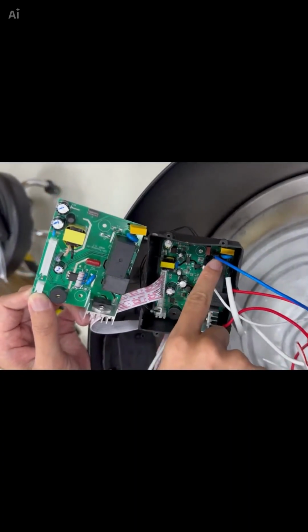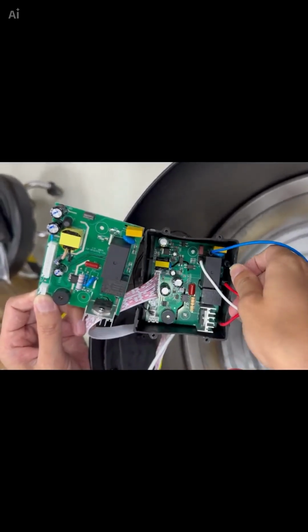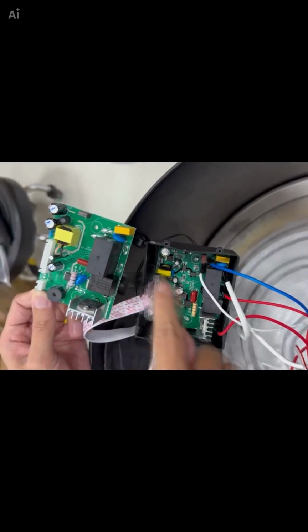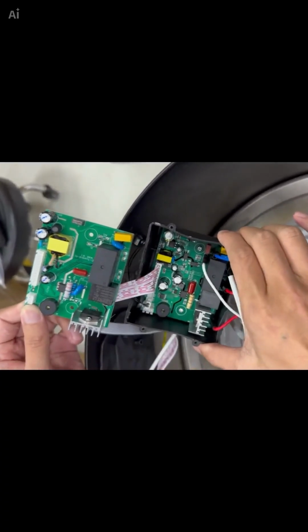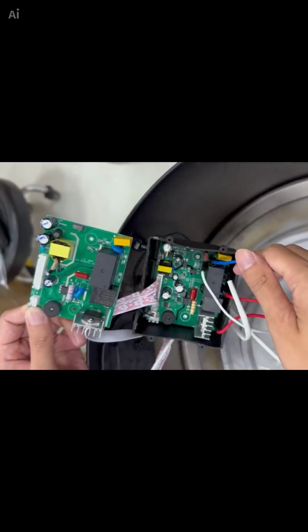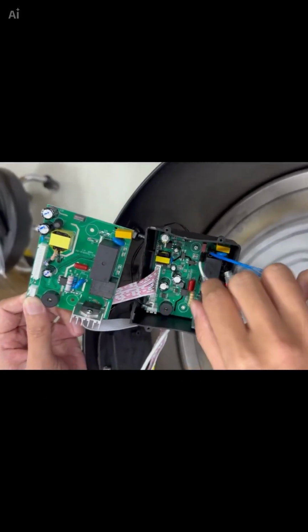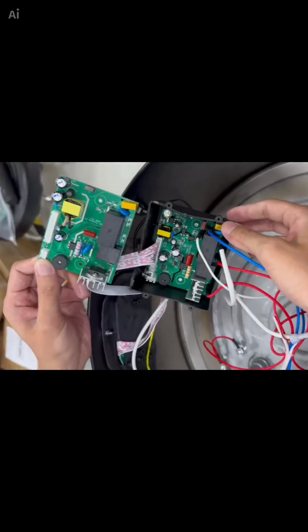Unplug this blue wire and plug it here. Unplug this white wire and plug it here. Then unplug this red wire and plug it here. And unplug this red wire and plug it here. Basically, the circuit pins of the 2 circuit boards are almost the same. You just need to unplug one and plug in another to accurately connect at this position.